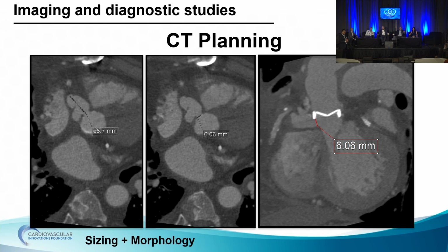So this is kind of the three-dimensional look at it where I could show the depth, that in the width aspect of it, it's about 6 millimeters. The height is 6 millimeters. Helps us better understand the actual neck of the pseudoaneurysm.